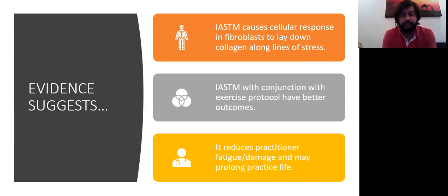This is what I will suggest: whenever any practitioner is using IASTM, you are protecting your hands, you are reducing the fatigue and the damage to your joints and muscles while treating the patient. It's common sense that if I am not comfortable while applying any kind of technique, how will I give comfort to the patient?